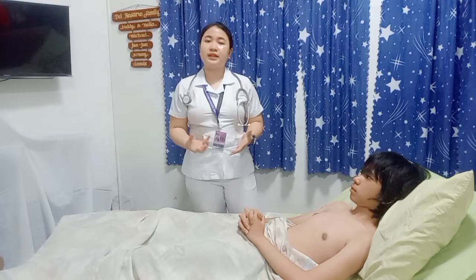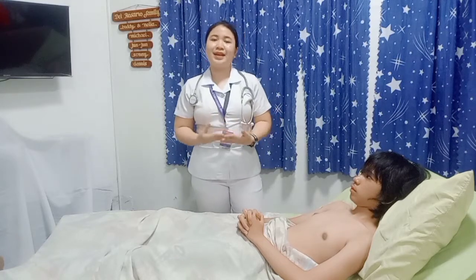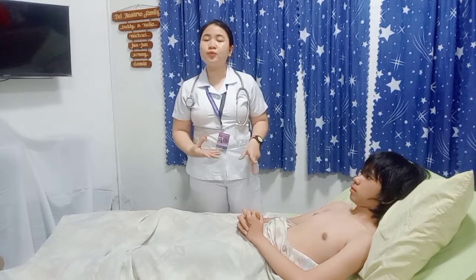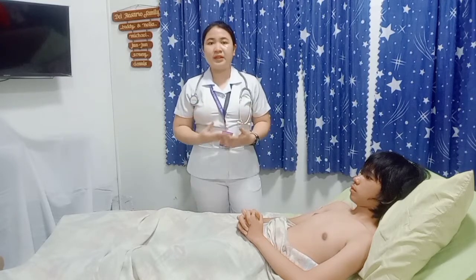Next, I will be auscultating the heart in all 4 anatomic sites, namely the aortic area, pulmonic area, tricuspid area, and apical area. So I will use the diaphragm of the stethoscope first to listen for the high-pitched sounds, and then afterwards I will be using the bell for the low-pitched sounds. So while auscultating, I am listening for the heart sounds, the S1 and S2, also for extra heart sounds and murmur.